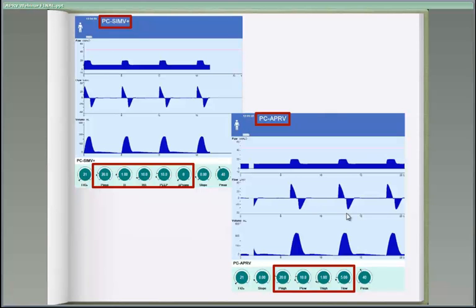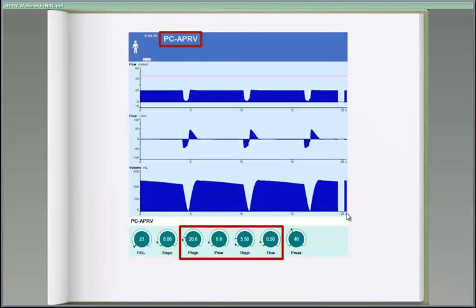behaves in general. So just to show you how we typically use it, we use APRV almost as a near CPAP type of ventilation. And you can see here that the duration of the inflation is extended. The release or the interruption of CPAP for ventilation is very, very brief, with the idea that you're retaining a portion of your CPAP level. And so we are really trying a modified version of CPAP, or you might even call it intermittent CPAP, one of the earlier names of APRV.